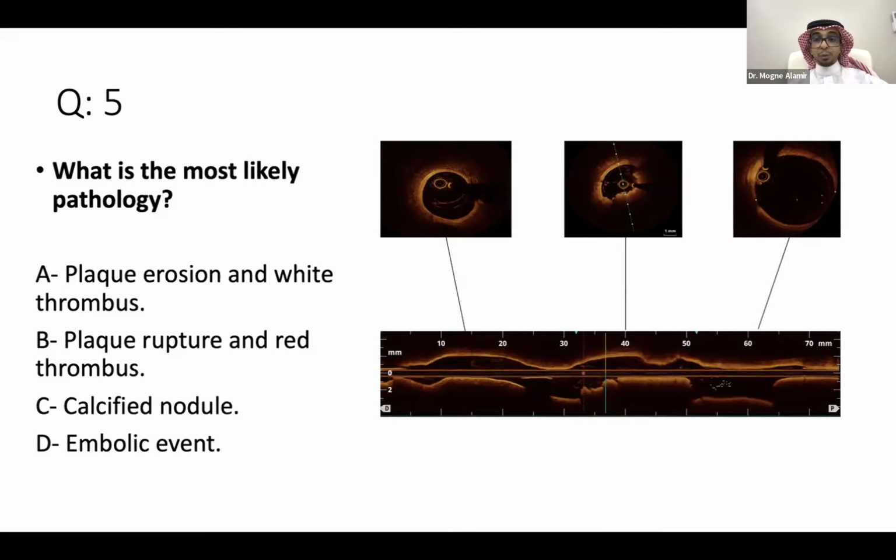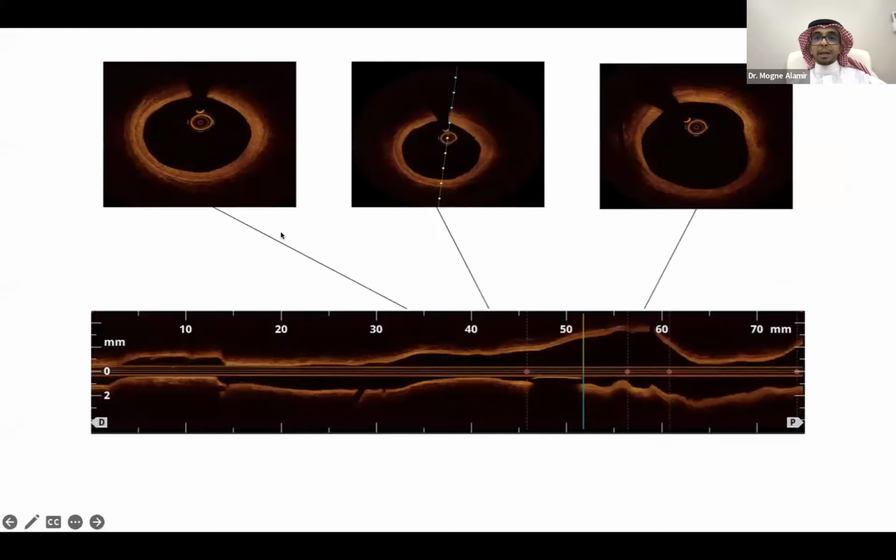We brought the patient back after 2 months, and we repeated the angiogram. We also did OCT, and this is the OCT after about 2 months. You can see that the distal area is almost normal. There may be some thickening of the intima. Here, the same, and also the proximal, but I don't think there is any plaque burden that can explain either plaque erosion or plaque rupture at the time of presentation. And we already have an explanation from the hematology diagnosis, which is essential thrombocytosis.